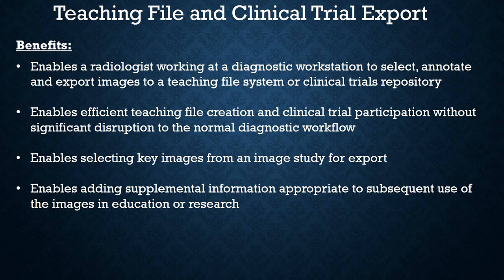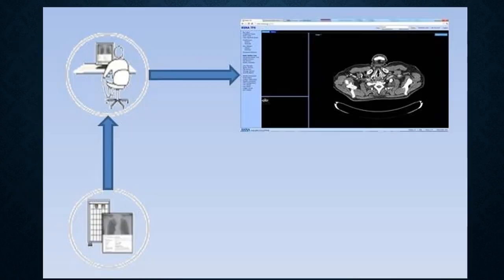The benefits: it enables radiologists working at a diagnostic workstation to select, annotate, and export images to a teaching file system or a clinical trials repository. Enables selecting key images. Enables efficient teaching file creation and clinical trial participation without significant disruption to the normal workflow. There are several benefits. I'm not going to read the last one because I just don't want to.